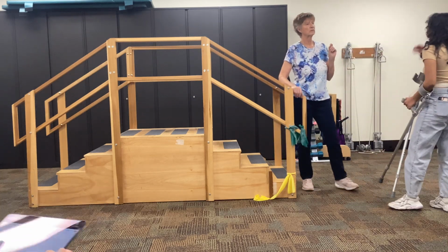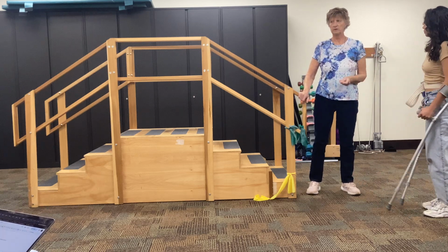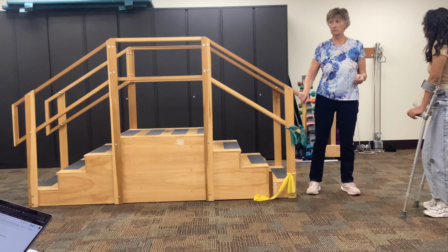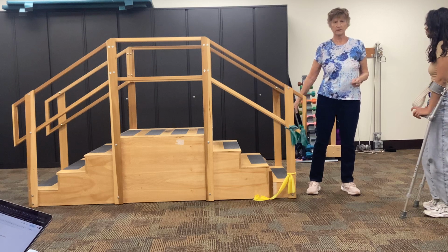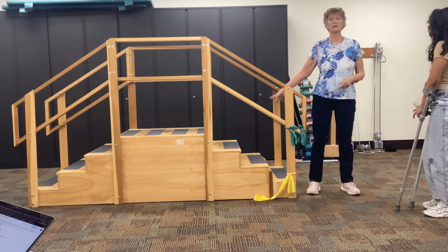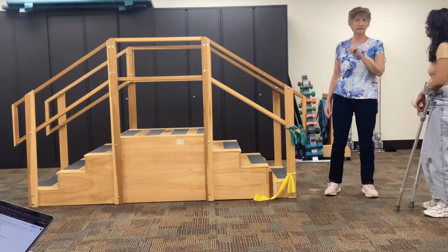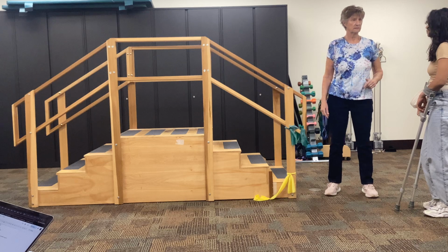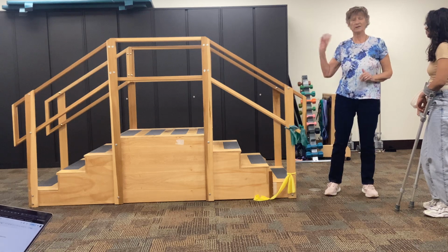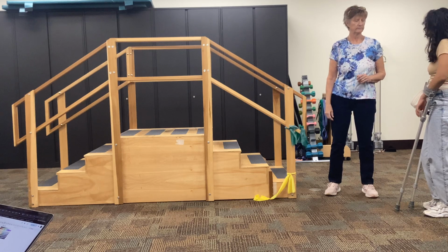So, again, for that particular one, what I want you to do is to try it with a partner. Just try a stair. I don't expect you to get all the way up the stairs. I do not expect you to become competent in this particular gait. All the other ones, yes. But this one, so you have a feeling of what your patient's going through.